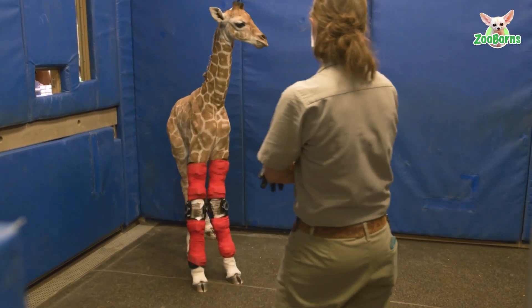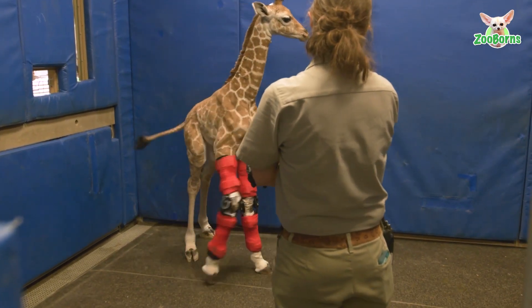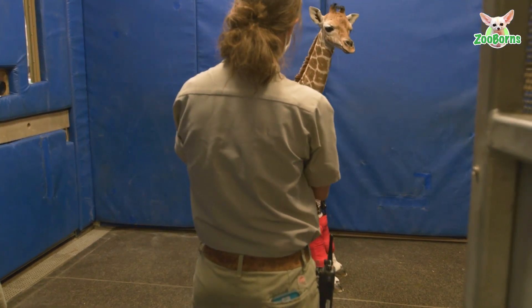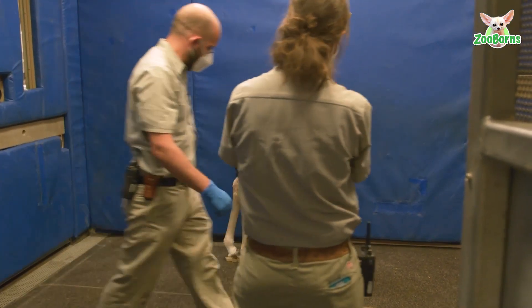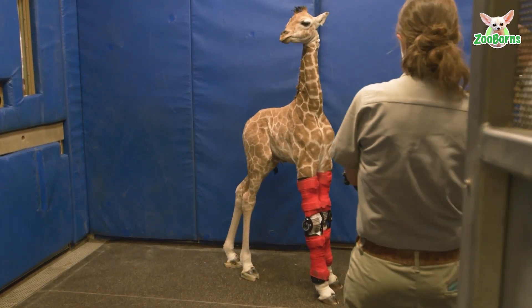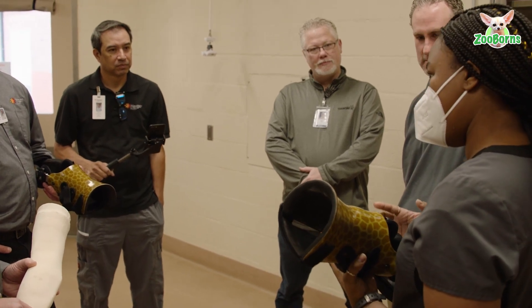The brace is adjustable. It's adjustable in circumference because we put extra padding in it — that way we can peel off layers. But we couldn't make it adjustable for height. The only reason is because it would have weakened the brace quite a bit, and we didn't want the brace to break and injure the giraffe.